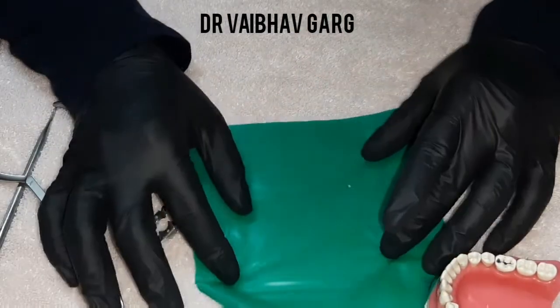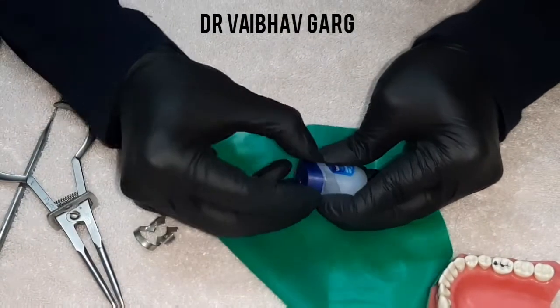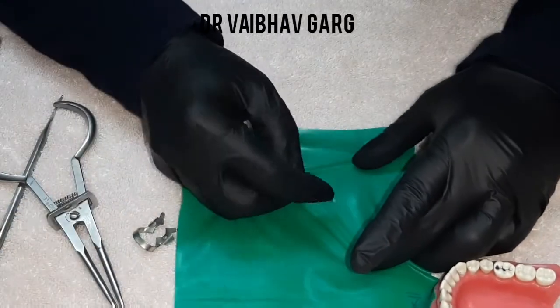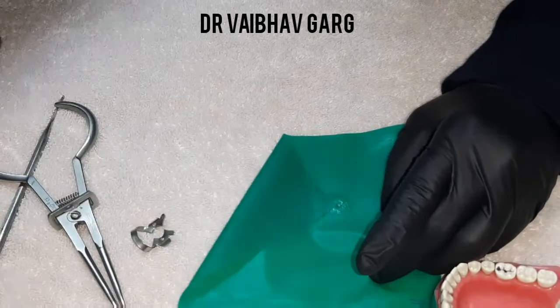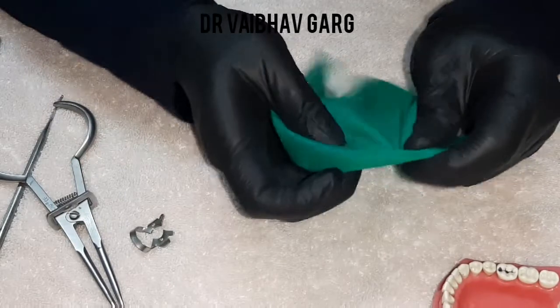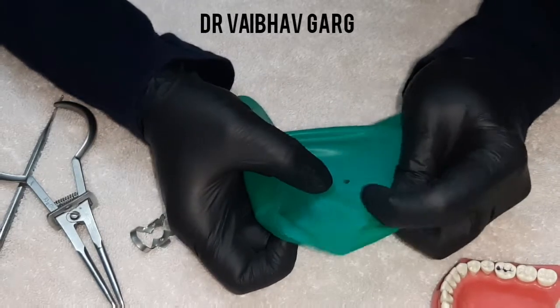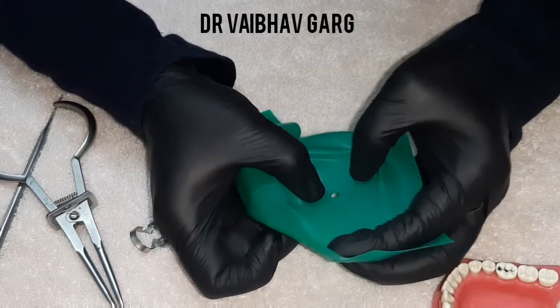In certain practices, Vaseline or petroleum jelly can be coated onto the area of the punched hole. Some say petroleum jelly can cause slight deterioration to the sheets, but so far I have not experienced such deterioration in sheet consistency.